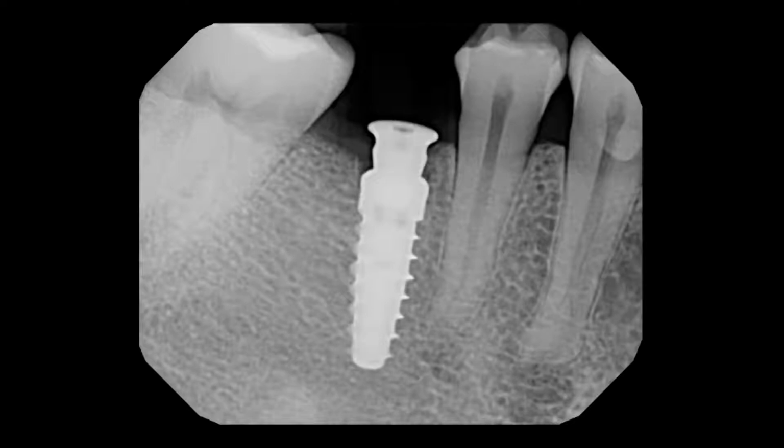So another case where if you're incorporating implant dentistry into your practice, this case would be ideal because there's plenty of bone interproximally, mesiodistally, buccolingually, and also the nerve is far enough away from the apex of the roots in the implant where I can feel confident that I can place that implant without hurting the patient.